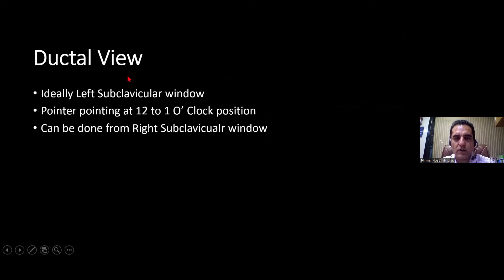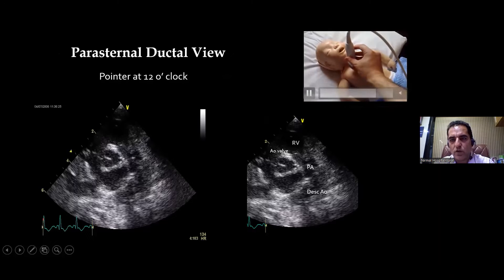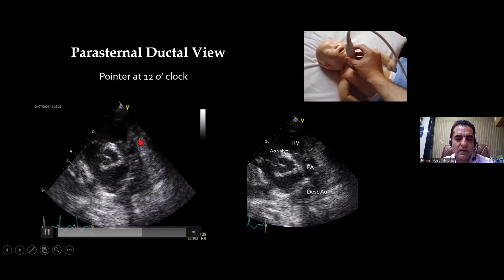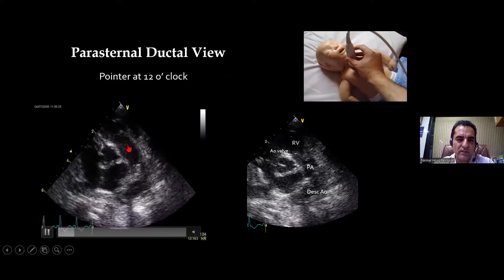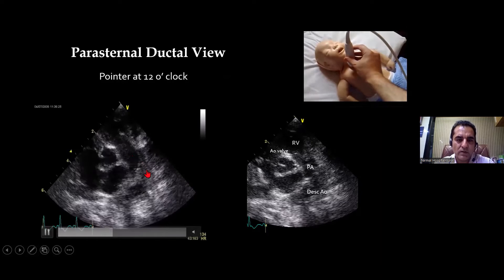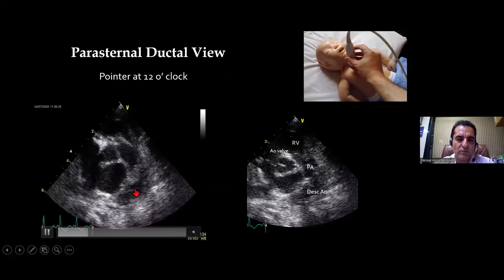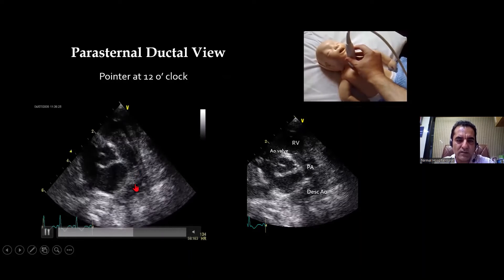The ductal view is one of the most important views for neonatologists. It is obtained in the left subclavicular area with the probe pointer at the 12 to 1 o'clock position, orientation marker pointing up. This is a modified short axis view where you see the aorta in cross-section. You can also see the pulmonary artery and the descending aorta. If a PDA is present, it always starts from the descending aorta and connects towards the pulmonary artery.